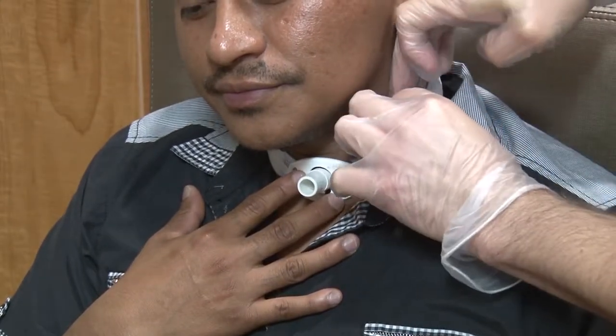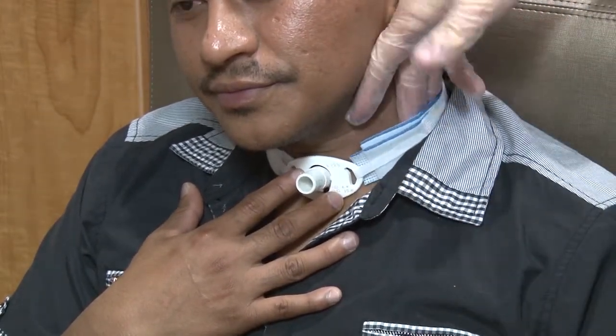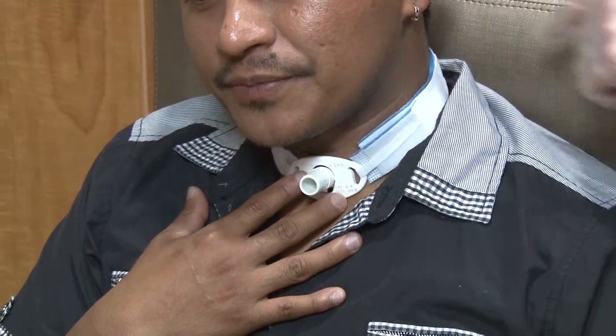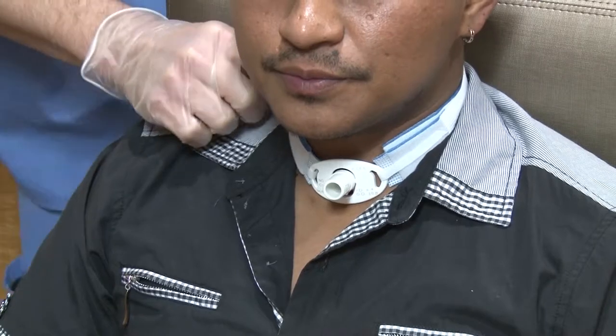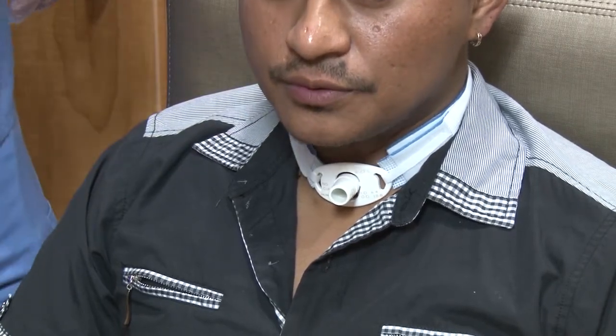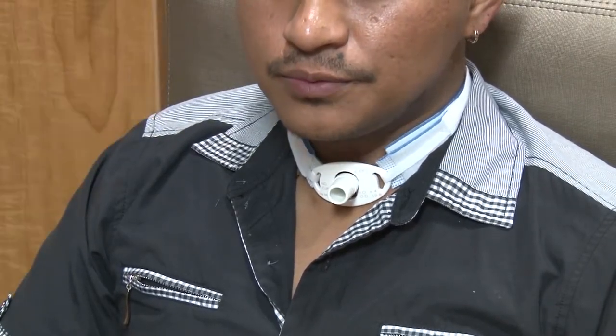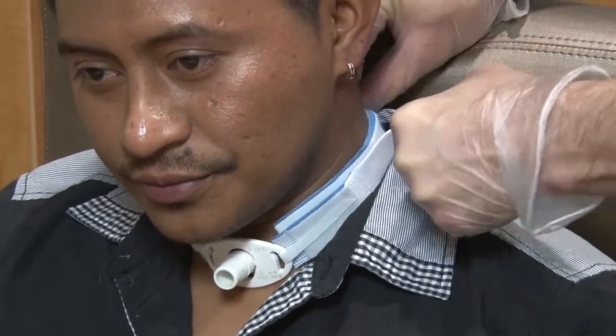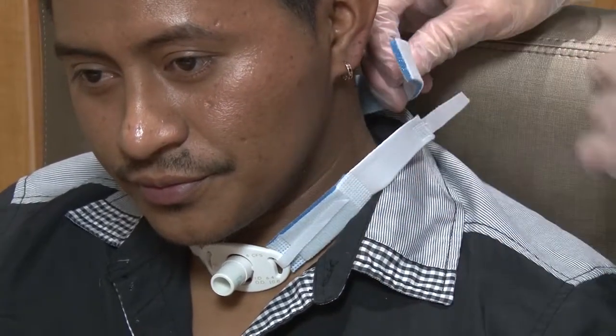You should be able to put two fingers under the neckband between the band and your neck when you are done. Loosen or tighten the neckband so that it fits your neck. If you have too much extra band, you can cut the long end of the band with scissors.